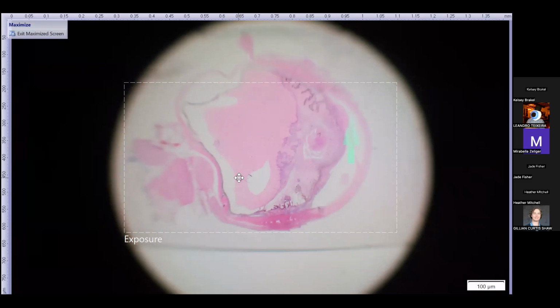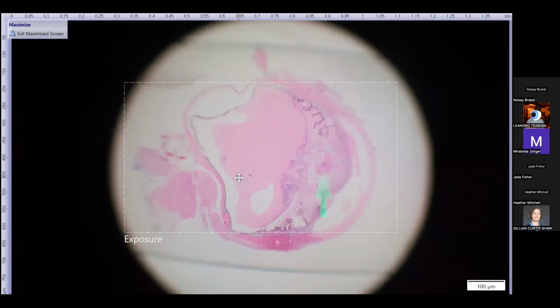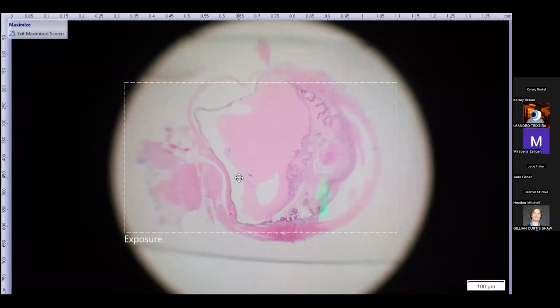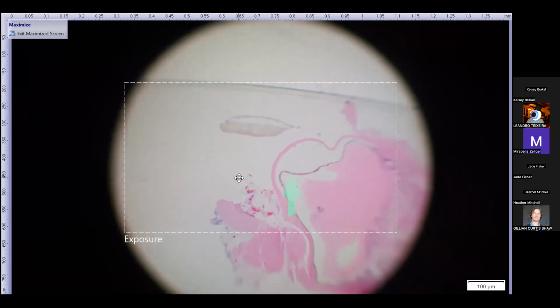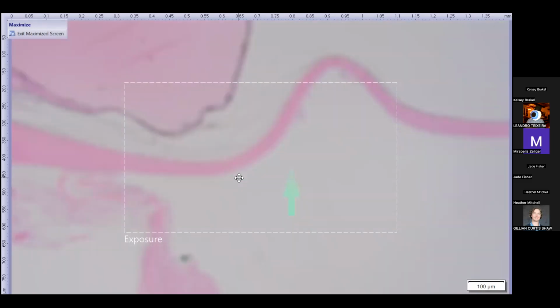All right, so cornea up at the front. Got this darker purple or pink here, where is remnant lens. We've got all the protein fluid in here. This wrinkled material here is the retina. And as far as sectioning artifact, here is the foreign body that was outside the eye. I'm not sure if it fell out during processing or if the histotechnicians needed to move it so they could get a nice section for us, but at least it is still on the slide.